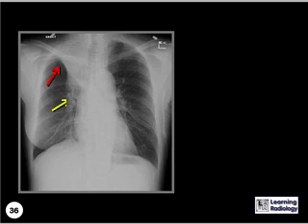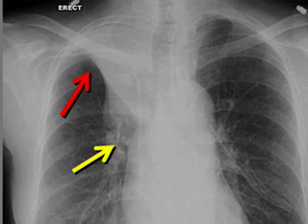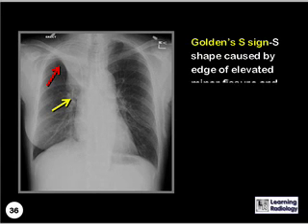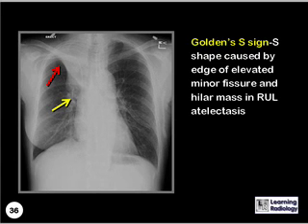What is the name of this sign? This is Golden's S-sign, or the reverse S-sign of Golden, which is an S-shape caused by elevation of the minor fissure and a hilar mass producing right upper lobe atelectasis.